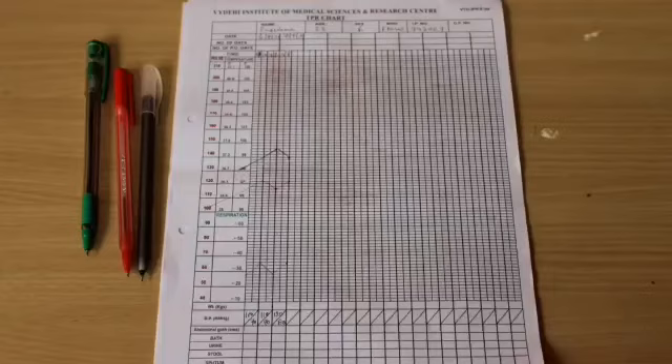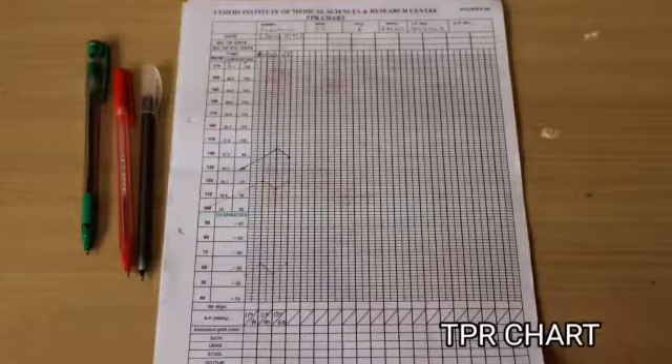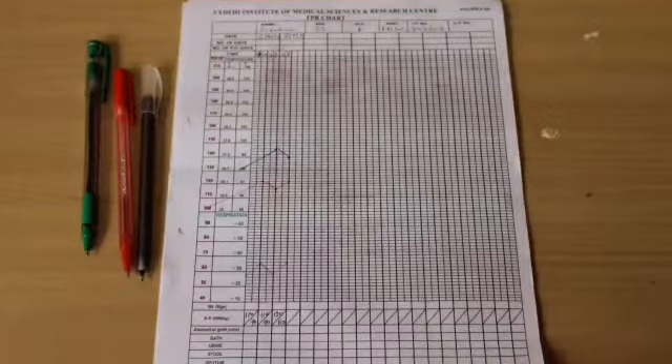Now we will show how to record the TPR chart. First, note the patient details. With a black ink pen, mark the temperature; with a red ink pen, mark the pulse rate; with a green ink pen, mark the respiration rate and the blood pressure of the patient. At last, we have to document the procedure. Thank you.